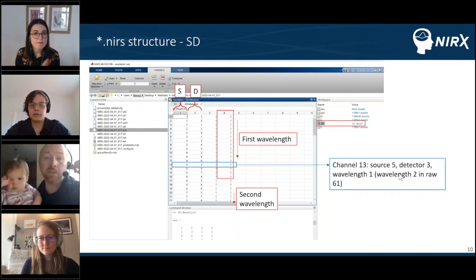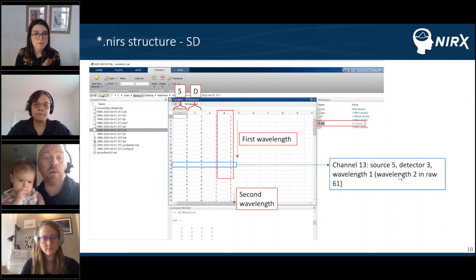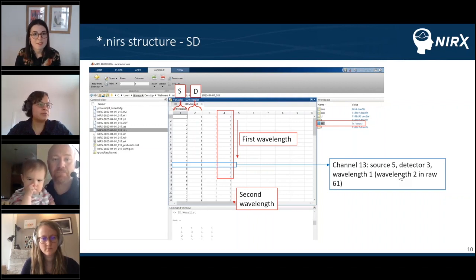It's actually frequency, a throwback to frequency domain NIRS, because the Homer2 software is able to handle frequency domain, like the ISS system. But for the NIRx, it's all CW, so that value will just be 1. Some of the other systems actually use it. That's really good to know. Thank you, Ted.